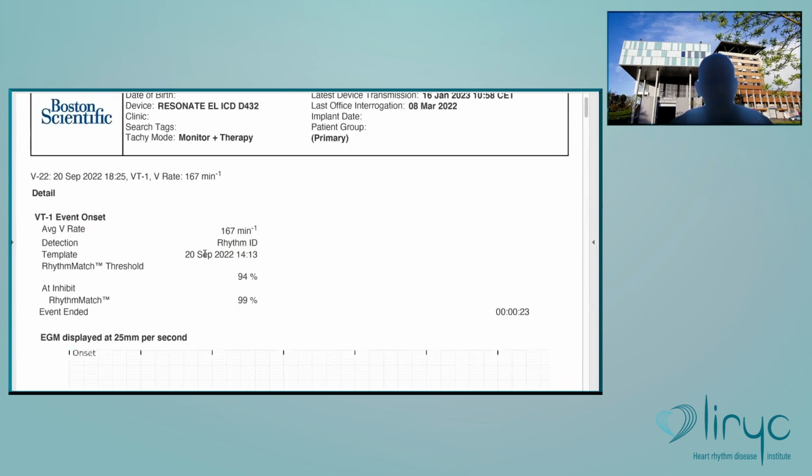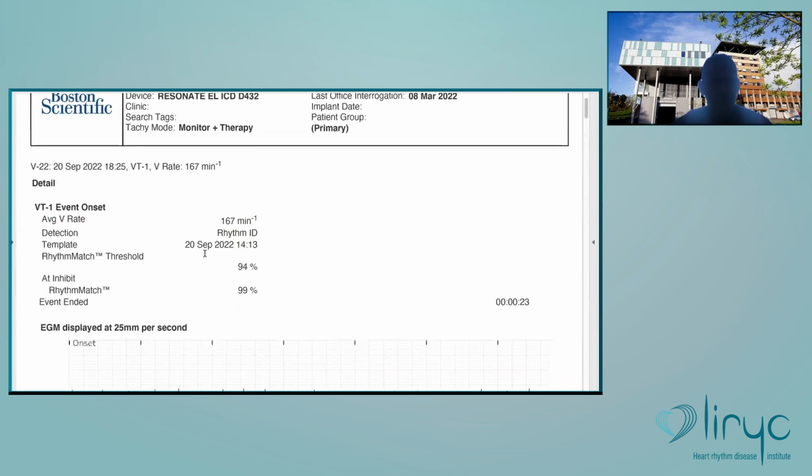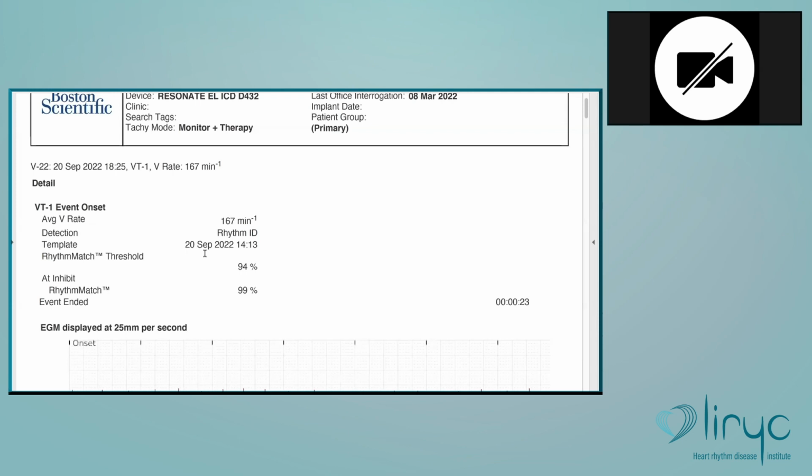Second one, what do you think here? Okay, again, an episode classified as VT with a rhythm match of 99%.